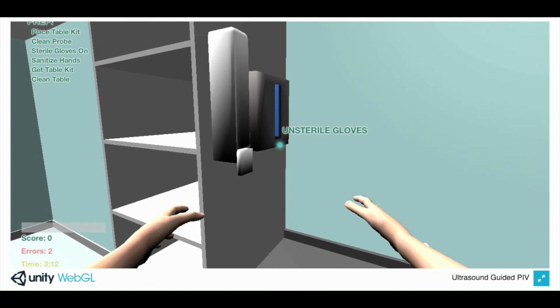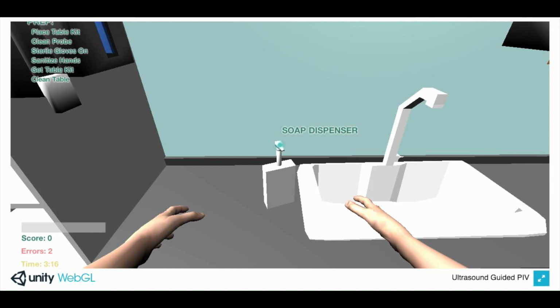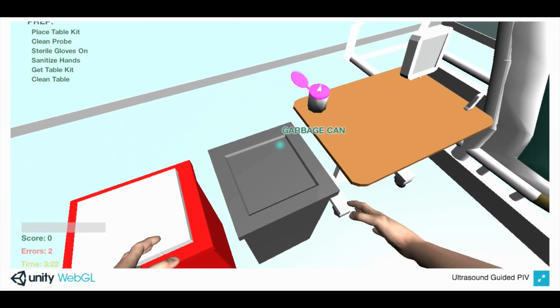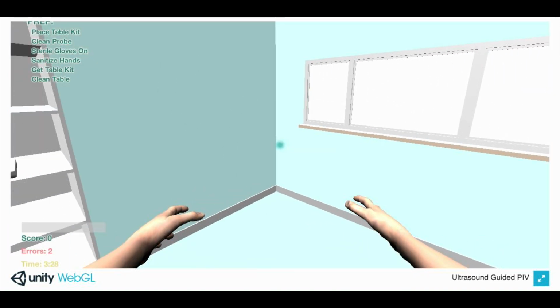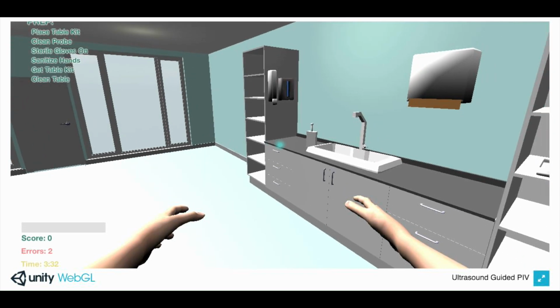Oh, and one more thing. We are a pretty tidy bunch here at PICC Excellence. If you have just washed and dried your hands and are standing there with a paper towel in your hand, your next step is to walk to the garbage can and throw away the paper towel. Same thing with wipes, empty glove packets, etc. Pick up after yourself along the way.